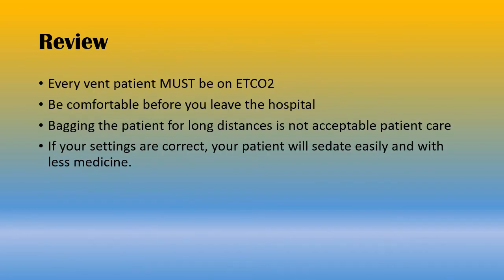Reviewing for this module. Absolutely every patient that you put on the ventilator must have end-tidal CO2 monitoring. You need to be looking at that waveform, monitoring the number, making sure you're doing what's right for the patient, and making sure that your vent doesn't just spontaneously stop working and the patient doesn't get to breathe. That patient is dependent on your skills and your ventilator. So everything you can do to monitor how that patient's doing, you should be doing it, including end-tidal CO2.